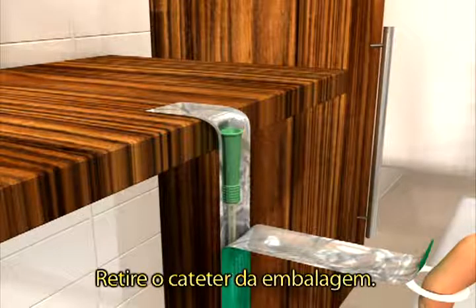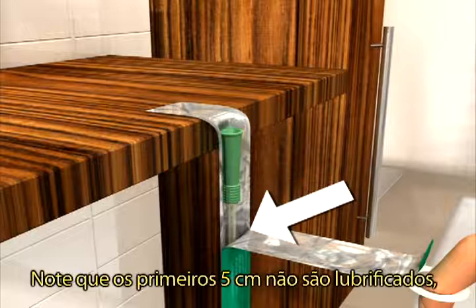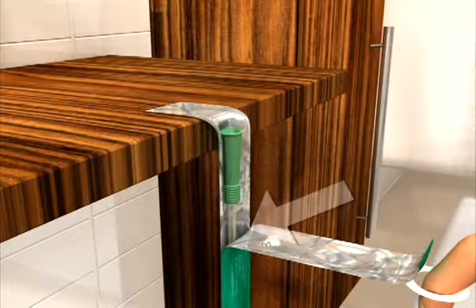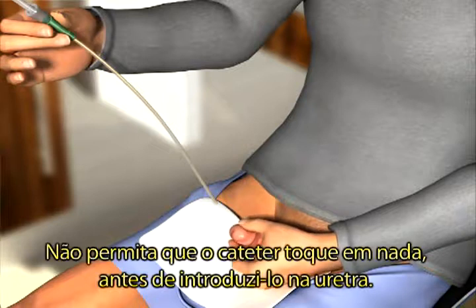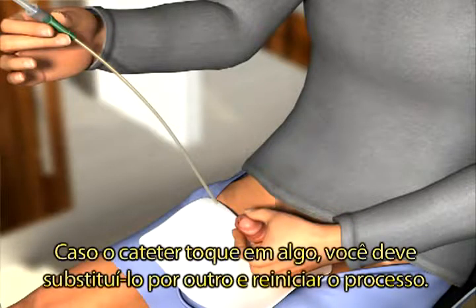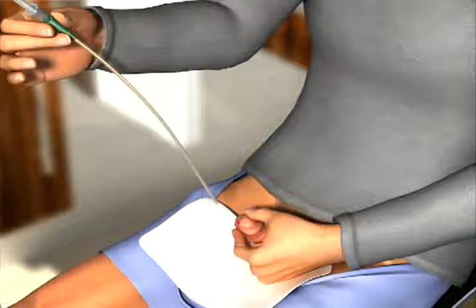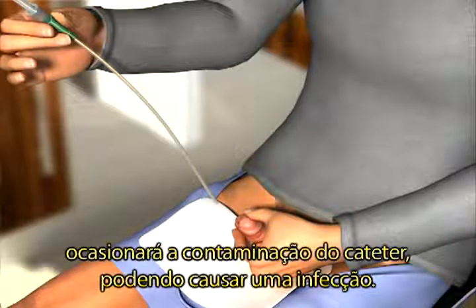Remove the catheter from the pouch. You will notice that the first 5 cm is lubricant free, so it is easier for you to hold. Make sure that the catheter does not touch anything before you enter it into the urethra. If it does, you must use a new catheter. Touching the sink, your clothes, or skin will contaminate the catheter and can potentially cause infection.